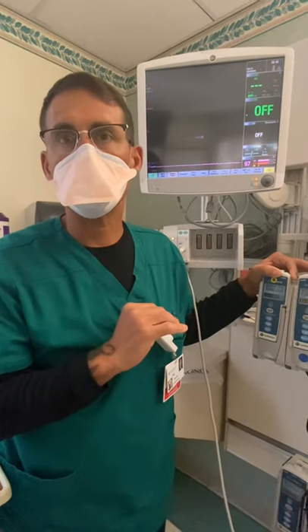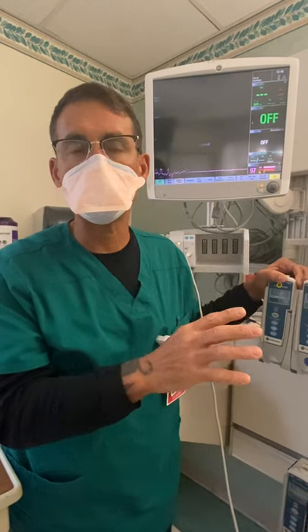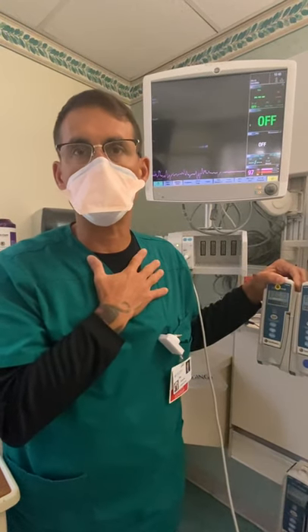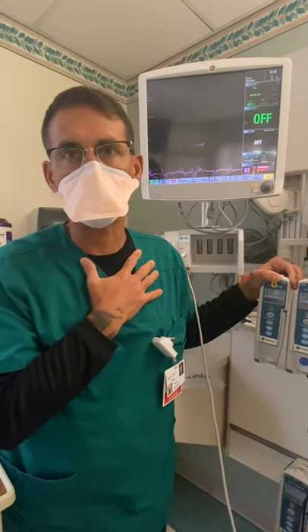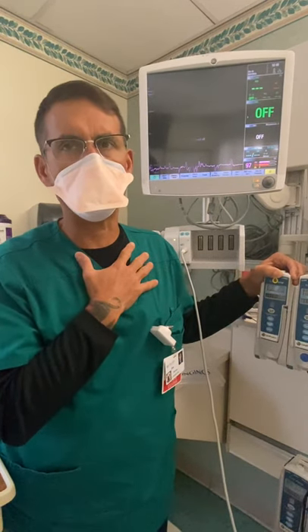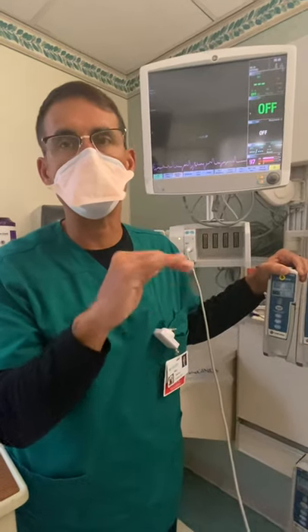We're changing the order. We're going to make it every 4 hour assessments on paralytics. But until we get the order fixed, I'm okay with you doing what's best practice, which is not to micromanage these drips. You still have to have train of four because we want to make sure they don't have zero, but you don't have to check it every hour once you've reached a certain level.